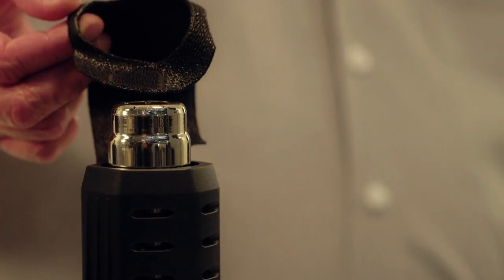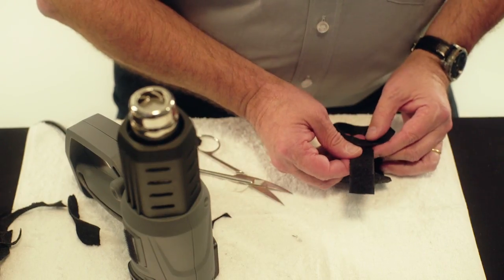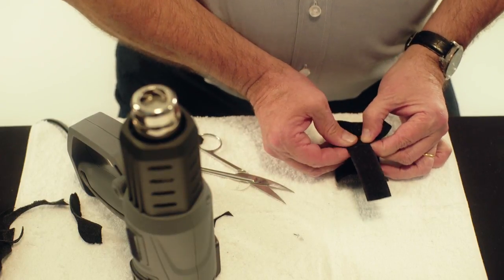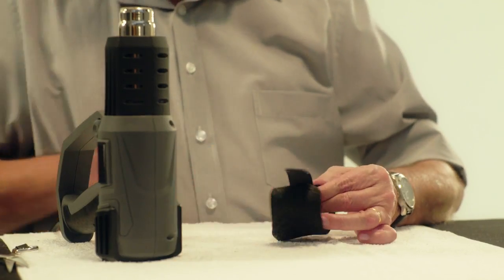Attach the Velcro loop by heating the orthosis on the inner portion of the opposite side and press the fuzzy side of the Velcro loop into the thermoplastic material.